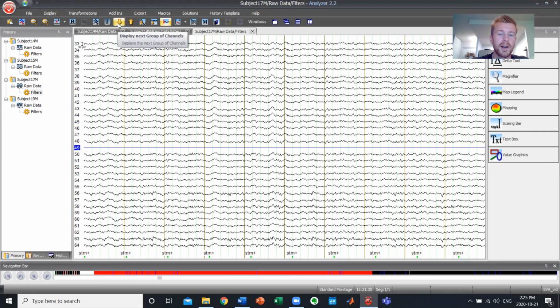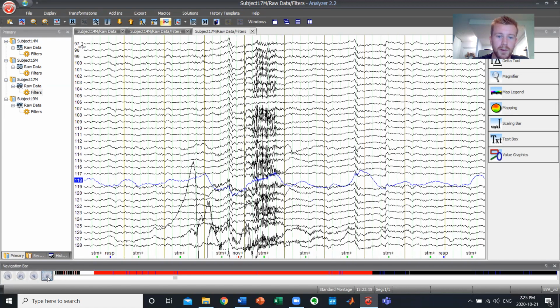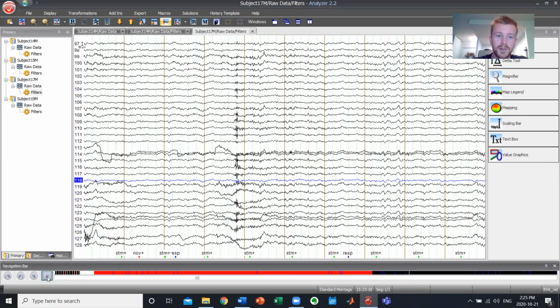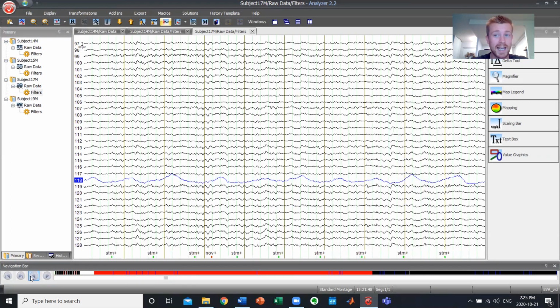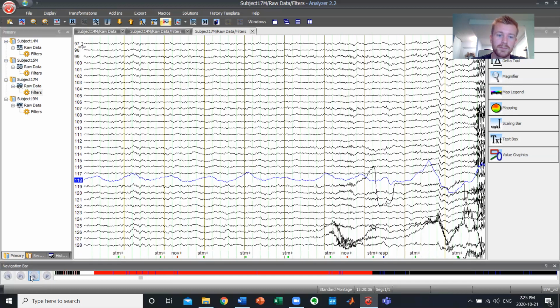Another example, and I already know because I looked ahead of time, is channel 118. So we can see here, this guy is kind of wonky. He's not terribly bad. This is actually decently clean data, but you can see that compared to everyone else, at least for the first half, he's pretty messy. So if you saw this, and even exaggerated, this actually isn't really terrible, you would want to deal with this by editing out the channel. And here you can see it's pretty bad.